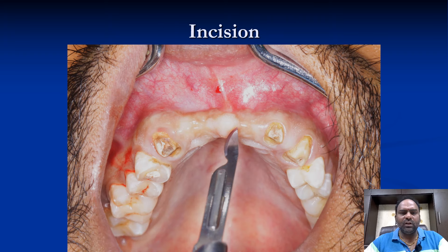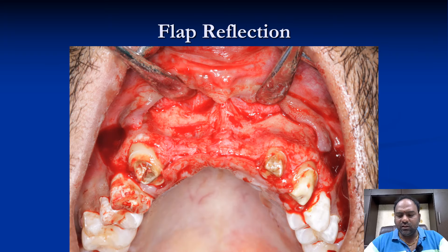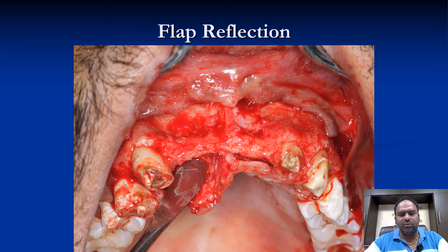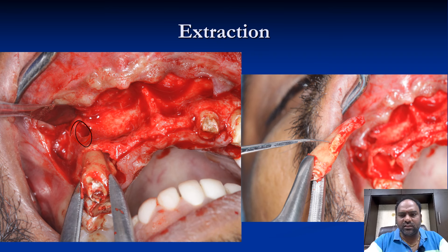We made the incision and performed the extractions. You can appreciate the length and width of the bone present here — only about 1 mm thickness of bone was there. After extraction, there was also some amount of dehiscence present, and fenestrations were noted as well.